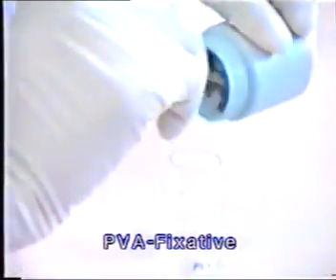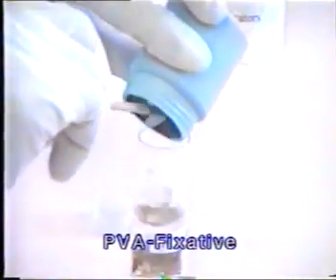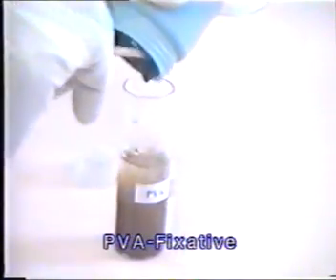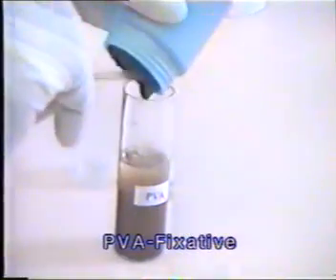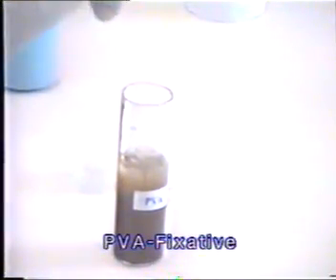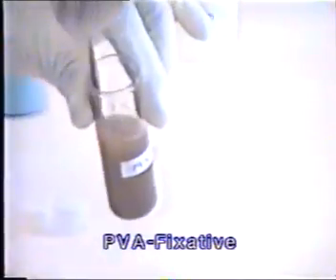Polyvinyl alcohol is an excellent preservative for intestinal parasites. Like with formalin, one part of faeces is added to three parts of the fixative and mixed thoroughly. Note that PVA fixative contains mercury chloride, which is toxic, so be careful when handling.